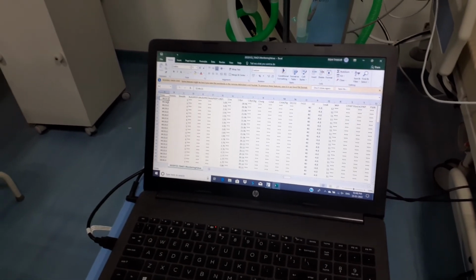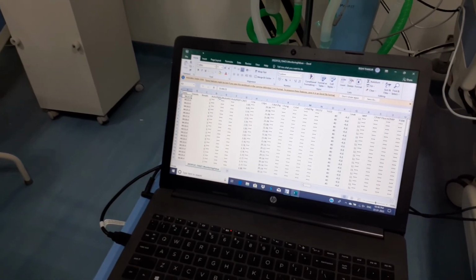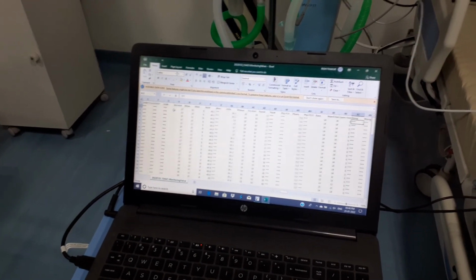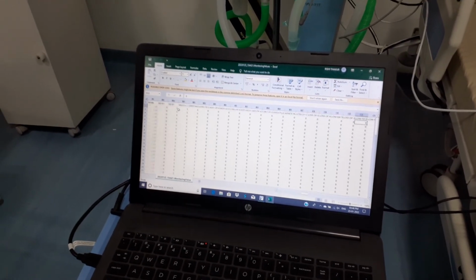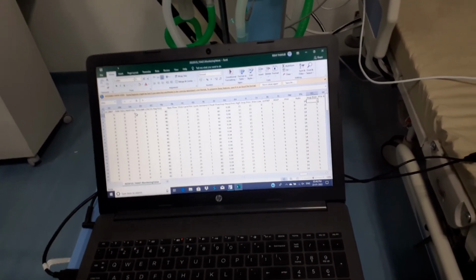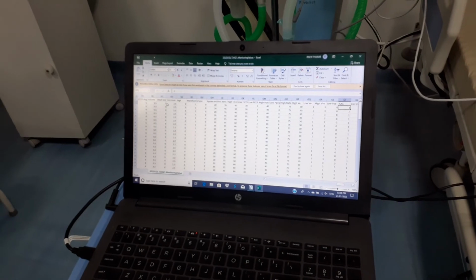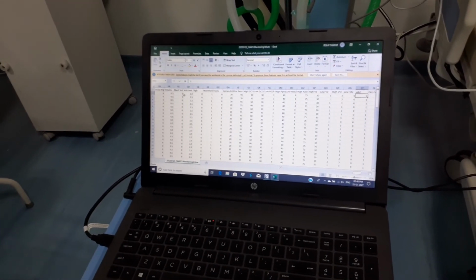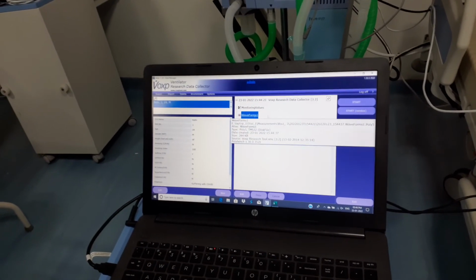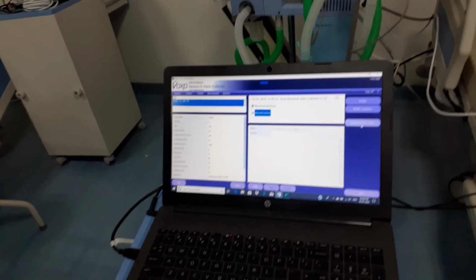This is the time, here you can see the exact time, and these are all the monitoring parameters which we are getting. These are the alarm settings, 0 because there is no alarm, and these are all the settings. So in this way we are getting 60 monitoring values, 60 settings and 91 alarms. And to get the waveforms, we have to click here and start converting the waveforms.